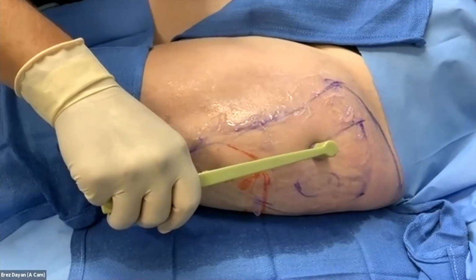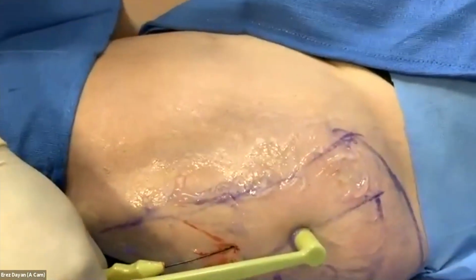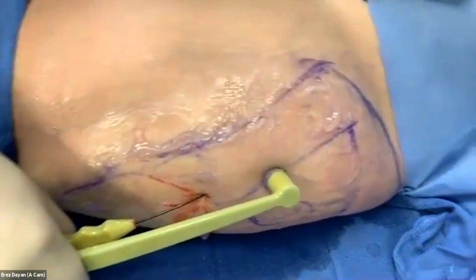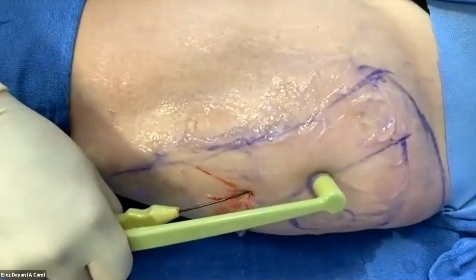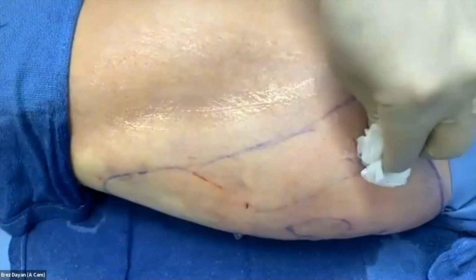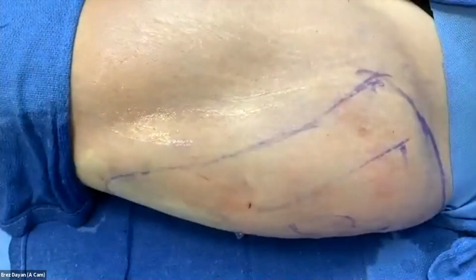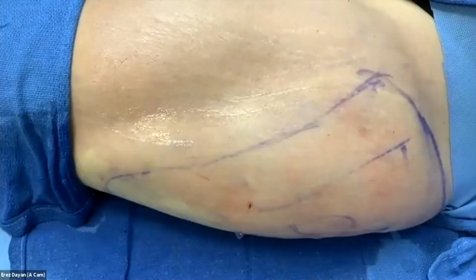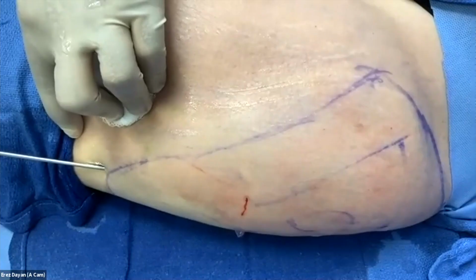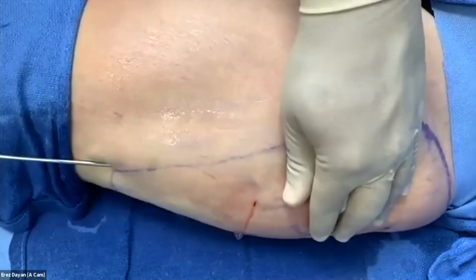For patients that have a really thick soft tissue envelope, you can stack the heat. You feel that? Okay, good. You can go deep and then go more superficial, so you're kind of layering heat. In this case, we don't really need to do that. She's young, so the radio frequency is kind of additive to the lipo. These are the best patients to do, though, the patients who have some adiposity. So this is just a 3 millimeter cannula, nothing crazy. I'm just coming in, debulking this area.